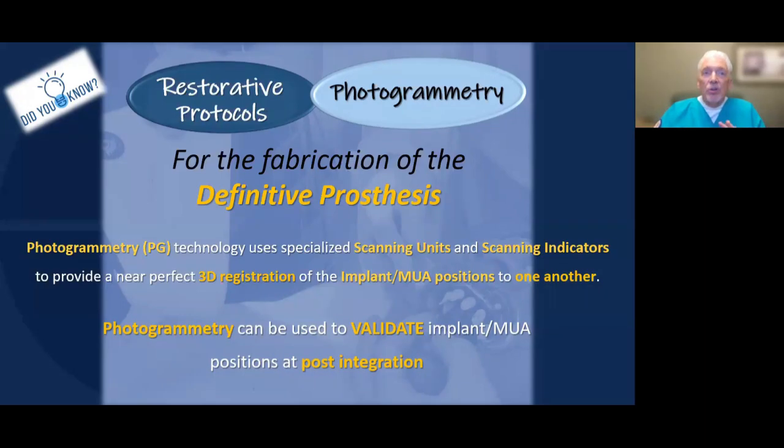However, when you're getting to this phase of the final, what you're going to use this for is to validate the positions at post integration. And this is really, for those of you that have it, be sure and use this technology at this stage, especially when there's been some bone grafting done. Many of you that have been doing these cases know that sometimes there might be an implant that we're not able to load immediately. So we leave it off the provisional and come back and pick it up at this stage.